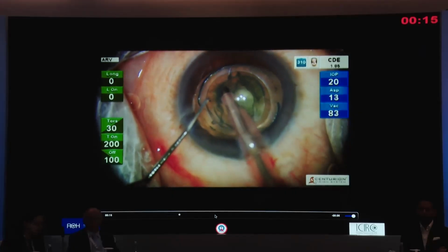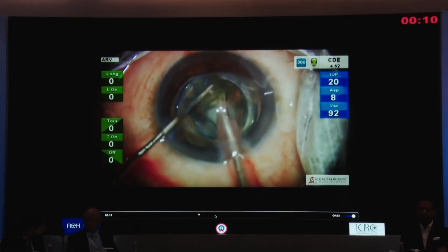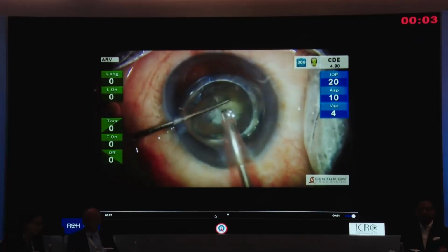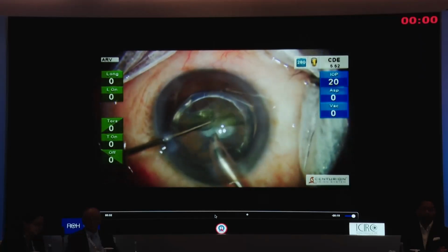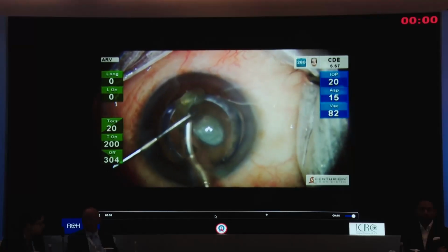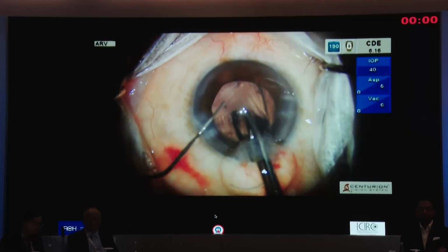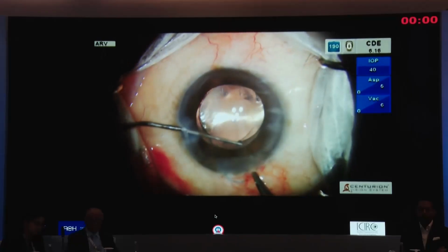The flow rate would be 16 or 18 or 20 depending upon the comfort, but as low as you're comfortable, and IOP very low. We don't want too much pressure there, although you want to prevent surge or a forward bulge. So on one hand, you want the pressure sitting on it, but have a balance of it. And typically with these flex techniques, it is not that difficult to present the material, and the same principle. And now I'm using a 3-piece IOL here, haptics in the sulcus, just behind the iris, in front of the anterior capsule.